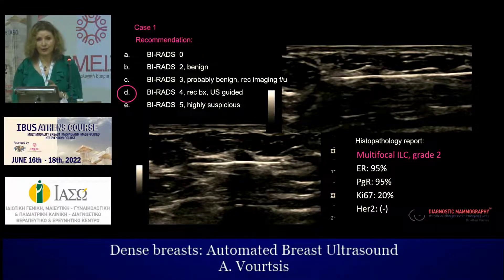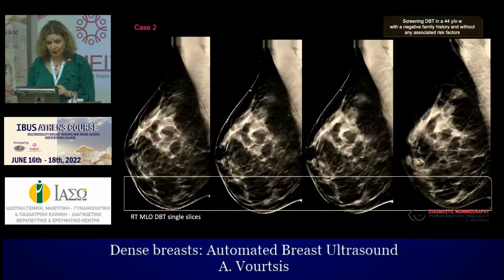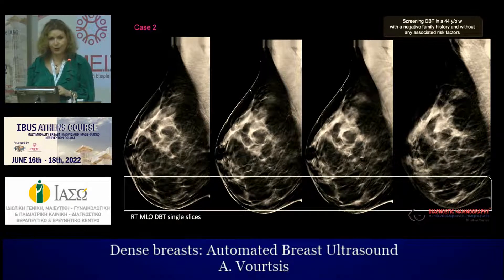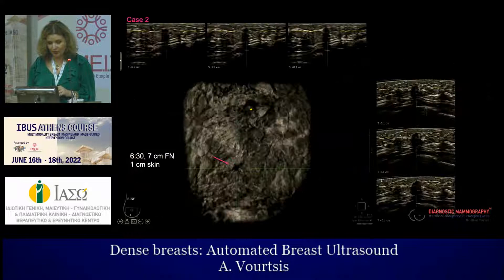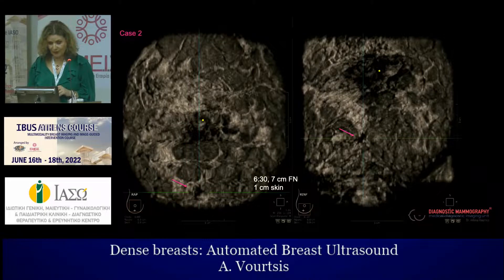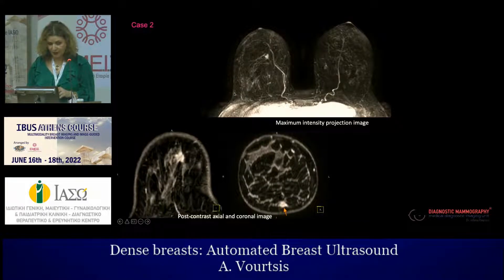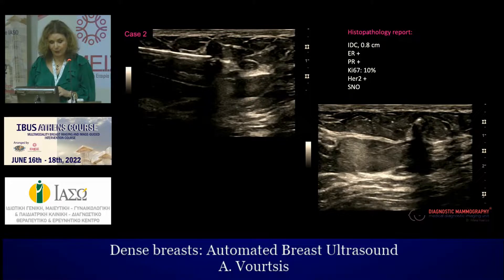We should keep in mind that it's not only extremely dense breasts where ABUS adds value — it is also heterogeneous dense breasts. Here is another case: a 44-year-old with screening DBT showing nothing to recall. However, on ABUS at six and a half o'clock, seven centimeters from the nipple, one centimeter from the skin, there is a suspicious mass — BIRADS 4. Biopsy under ultrasound guidance confirmed an invasive ductal cancer measuring 0.8 centimeters.